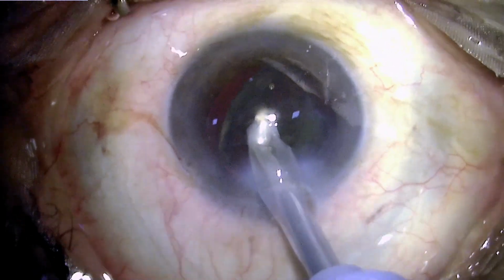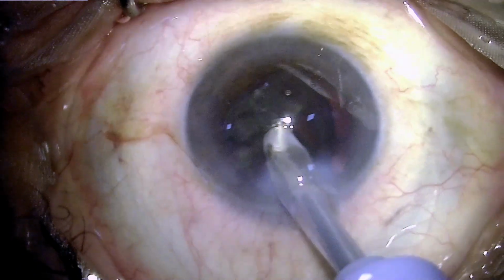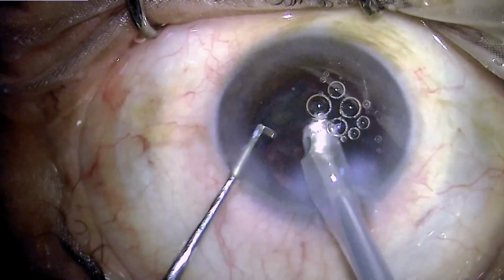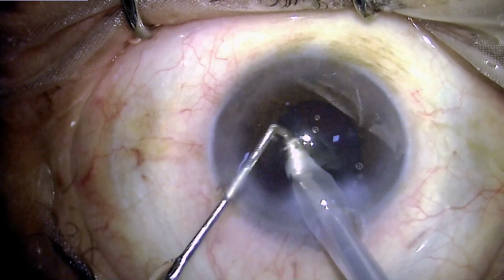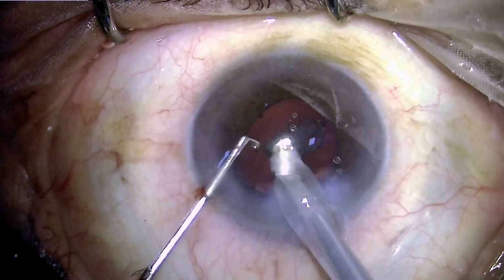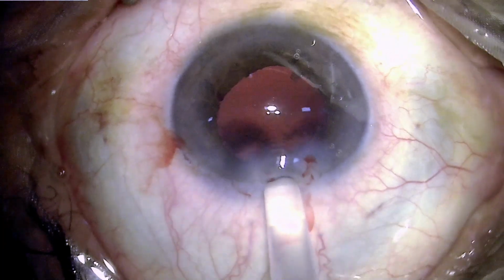Now what I would like to mention here is that it's very important, judging by this particular incident, that the staff should be well trained, because the surgeon, when he is operating, will have a greater concentration on the proceedings inside the eye, and what all is around in the OT, and any faulty instrument or fault occurring in the OT usually cannot be appreciated by the surgeon.